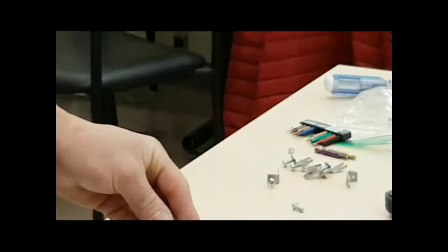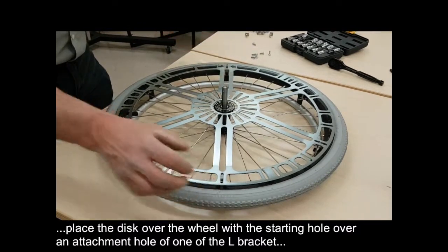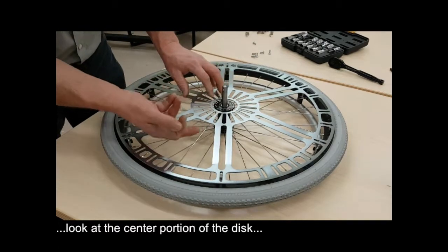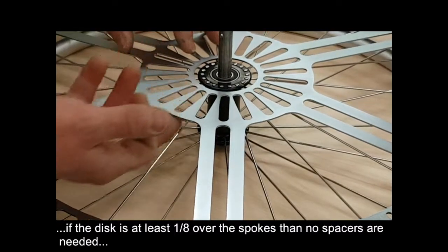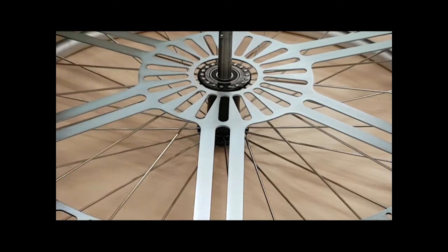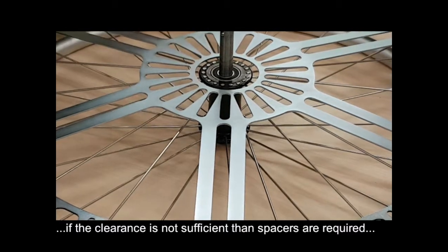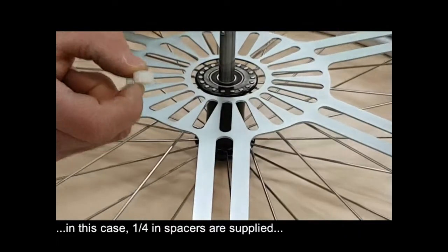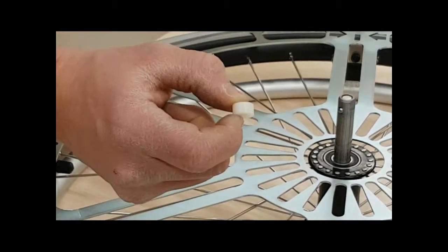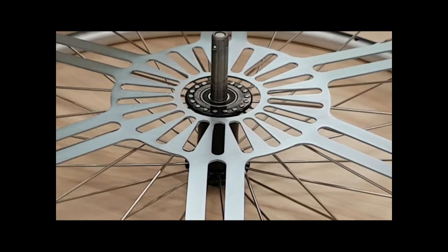So let's do that. We put it on the wheel itself, and then we look, without spacers, at the center here. And we see that there's enough space underneath so that the clearance is at least 1/8 of an inch. So in that way, we won't be using any spacer. Should that distance not be sufficient, then there are 1/4 inch spacers supplied with the kit, and you should be using these in that case. But for now, given what we have here, we won't be using any spacer.